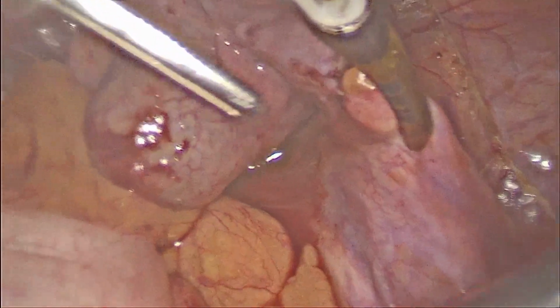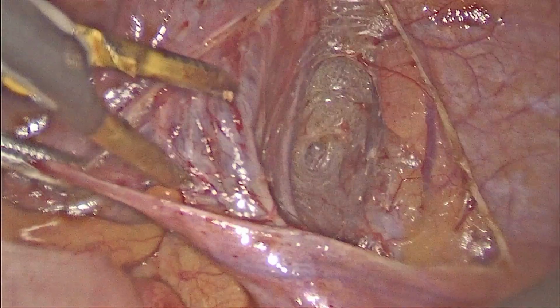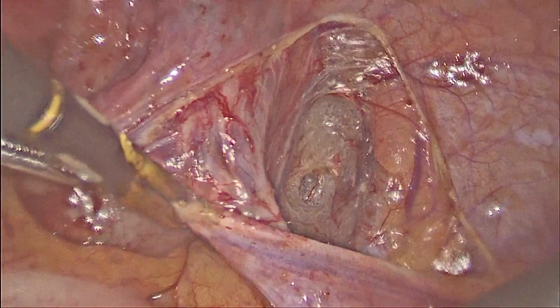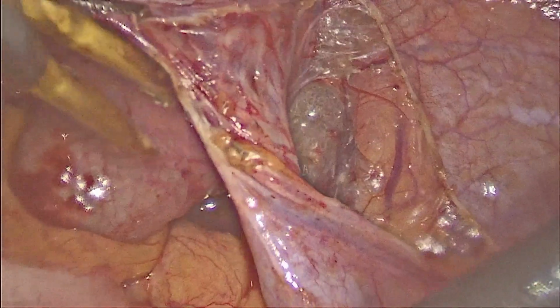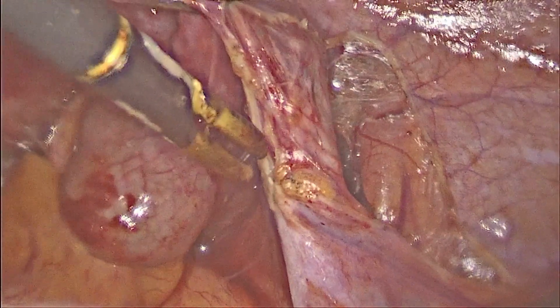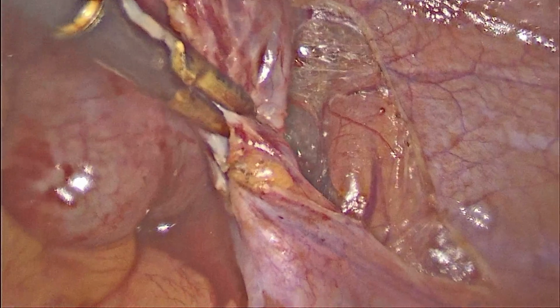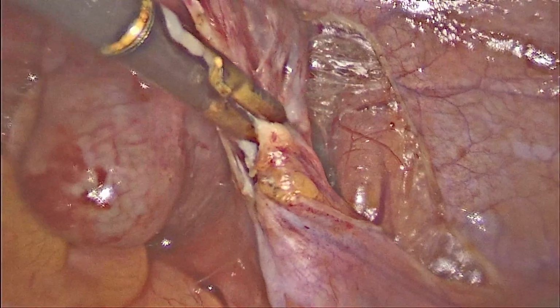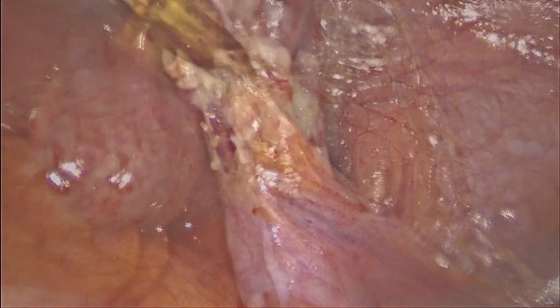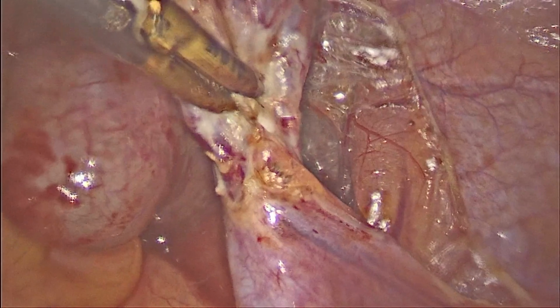So now we have identified the infundibulopelvic ligament, and we noted that the ureter is seen well away from the surgical field. Now we try to peritonize the infundibulopelvic ligament again before we coagulate it completely, so that there is no chance of the vessels retracting after division when incompletely coagulated. So before dividing it, it is better to have a complete coagulation of the vessels, and then we can divide it.